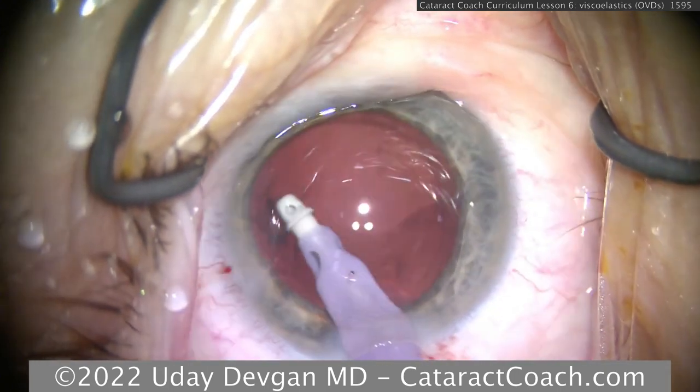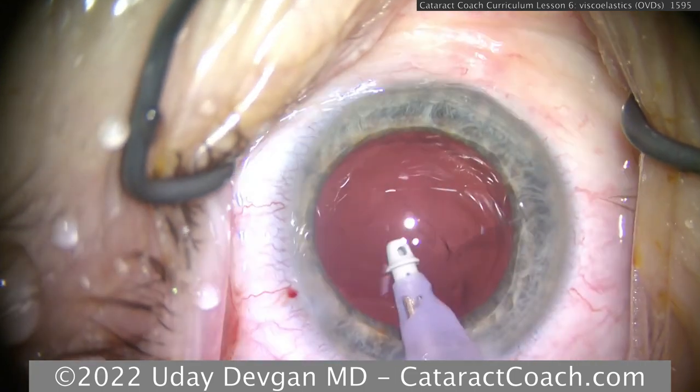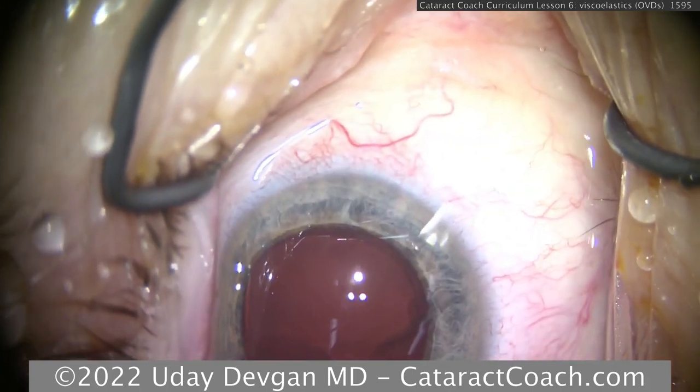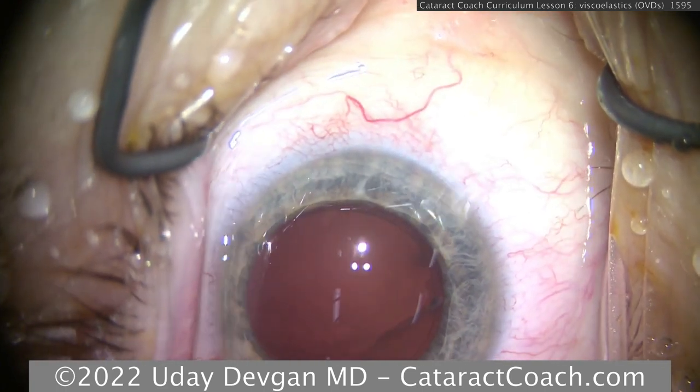And again, this is a very critical step to take your time. We don't want to damage that delicate posterior capsule, which can be as thin as 4 microns centrally. So just think about that. That's half of a red cell. A red cell is generally thought to be about 7.5 microns in diameter.